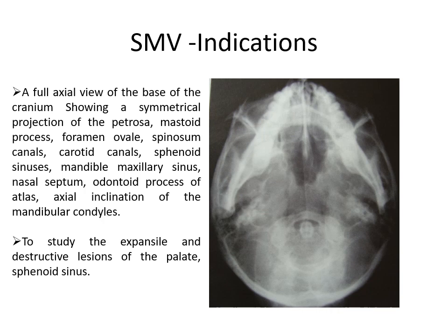These are the indications of the sub-mentovertex view.